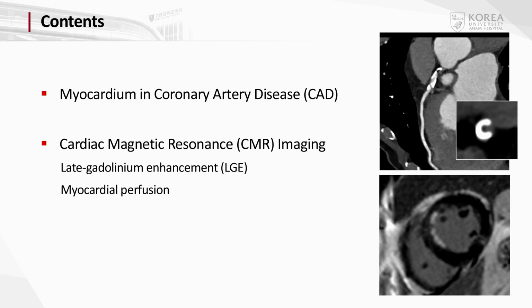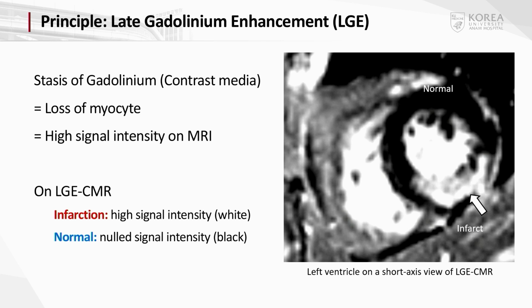Today, my talk focuses on the myocardial evaluation in patients with CAD, and I will explain how CMR assesses the myocardium using two core techniques, late gadolinium enhancement or LGE, and myocardial perfusion imaging. Let's begin with the principle of LGE.